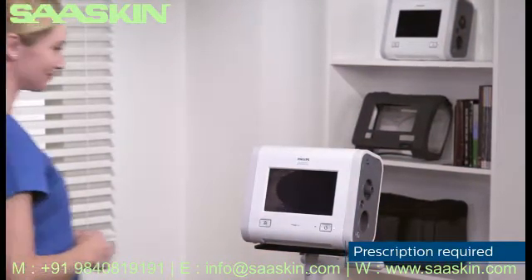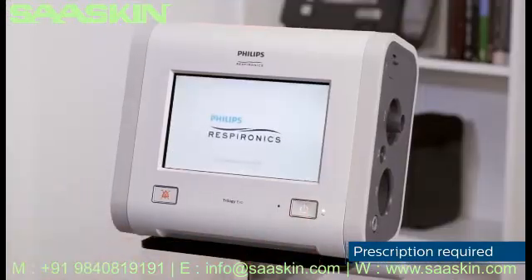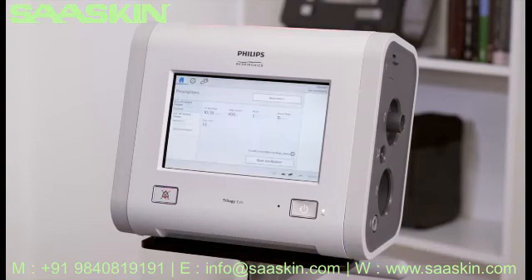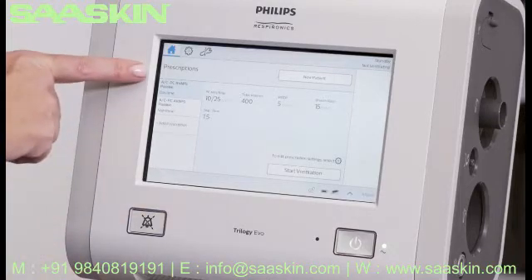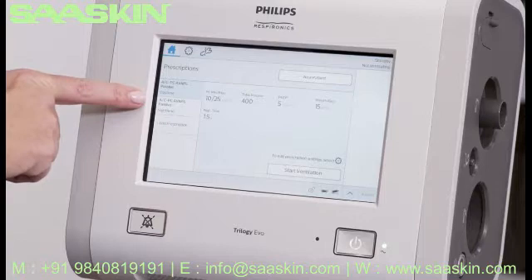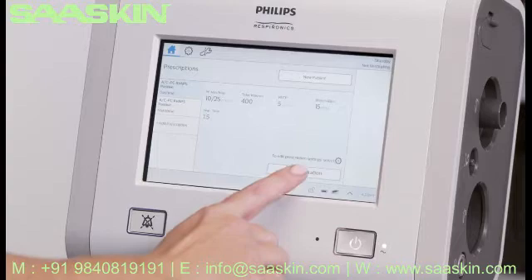Trilogy EVO has been designed with an easy-to-use touchscreen interface. In this video, we're going to demonstrate window navigation and some important functions including info help, battery information, monitoring views, and changing prescriptions. While in standby, on the home window, you can view the entered prescriptions on the left-hand side. On the bottom right of the window, find Start Ventilation.